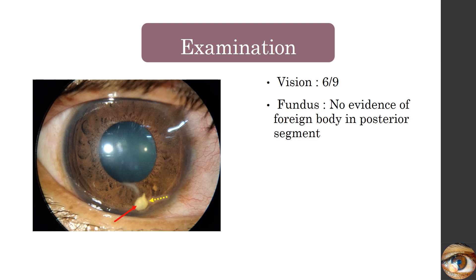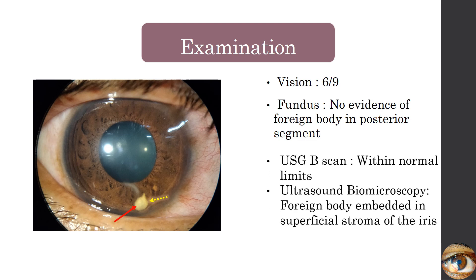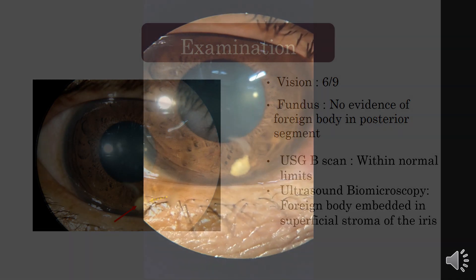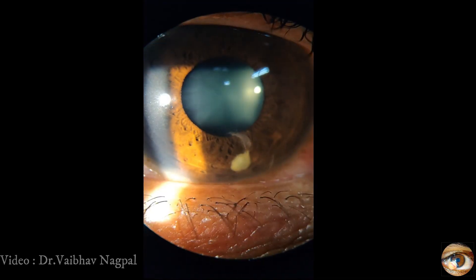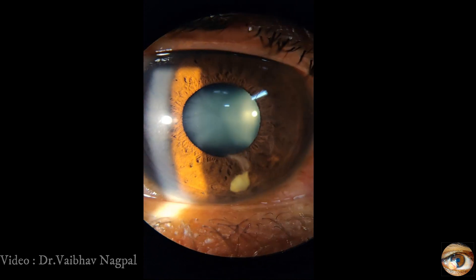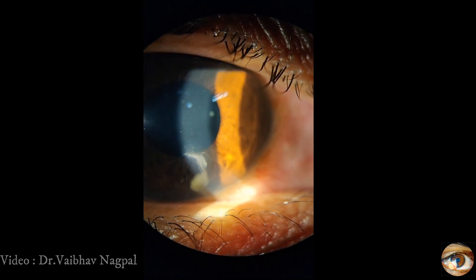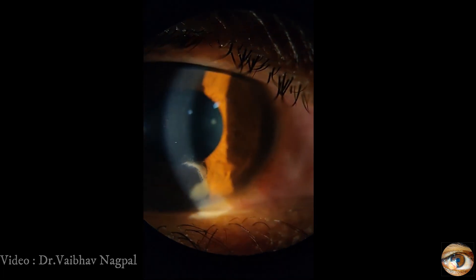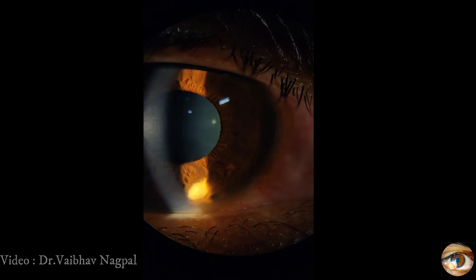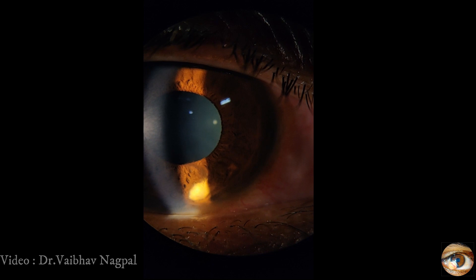A foreign body was found over the iris and the fundus examination was within normal limits. Ultrasound biomicroscopy showed that the foreign body was embedded in the superficial stroma. On slit lamp examination, we could appreciate that the chamber was well formed, there was a self-sealed corneal wound, and there was some fibrinous reaction over the foreign body.